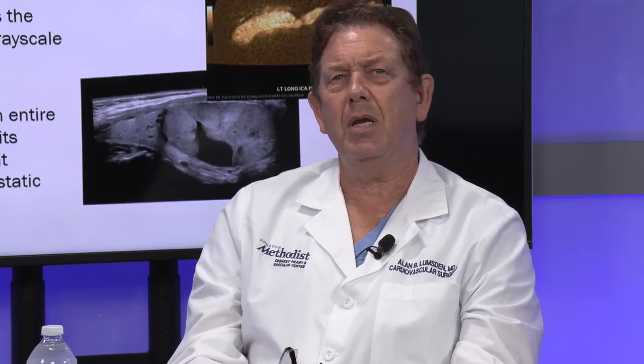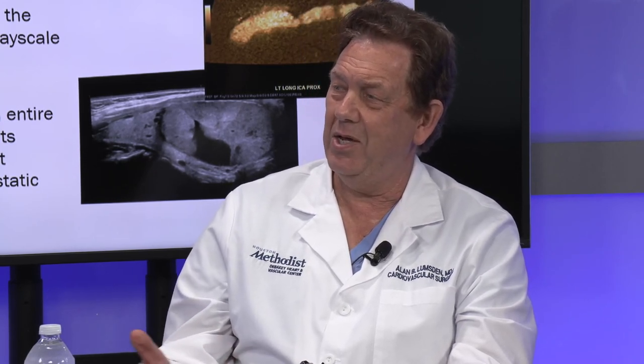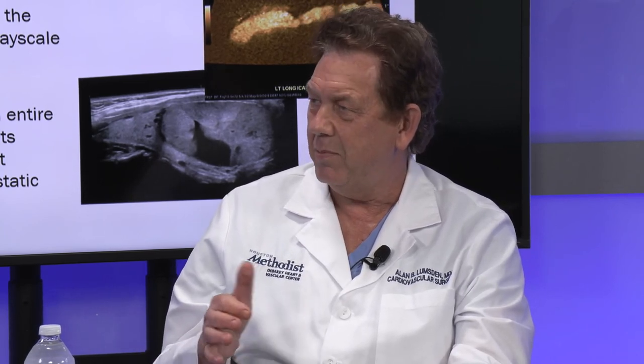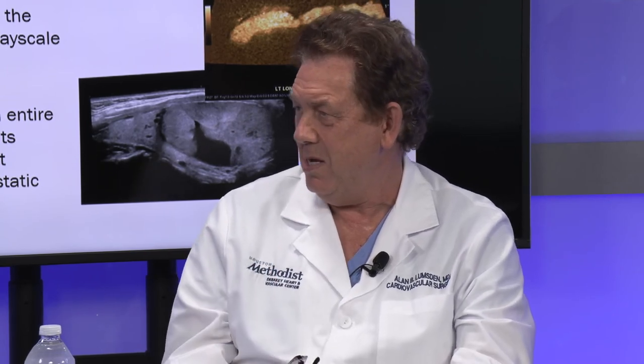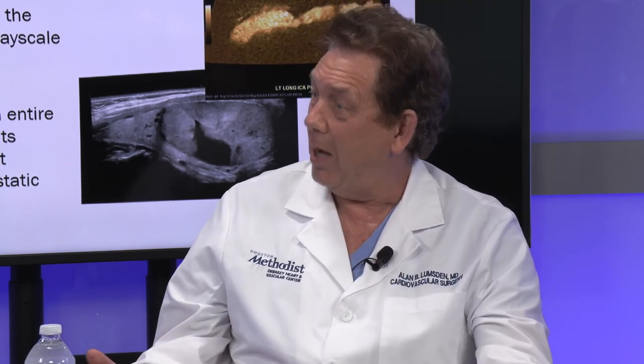Yeah. So basically the color Doppler is more velocity driven. When you have a near occlusion or you really want to see this trickle flow, then you turn to the power Doppler, which is not dependent on velocity. But I think the B-flow is even better because with the B-flow, you can really decide between near occlusions versus occlusions. So can I assume that if the patient comes to the lab with a near total occlusion, this will be done automatically on every case to rule it out? I understand if it's only 75% it's not relevant. But sometimes there's this question, is this already occluded or not? It's pretty important to me in the next phase of decision making. So is this the standard of care in our lab, in all labs?